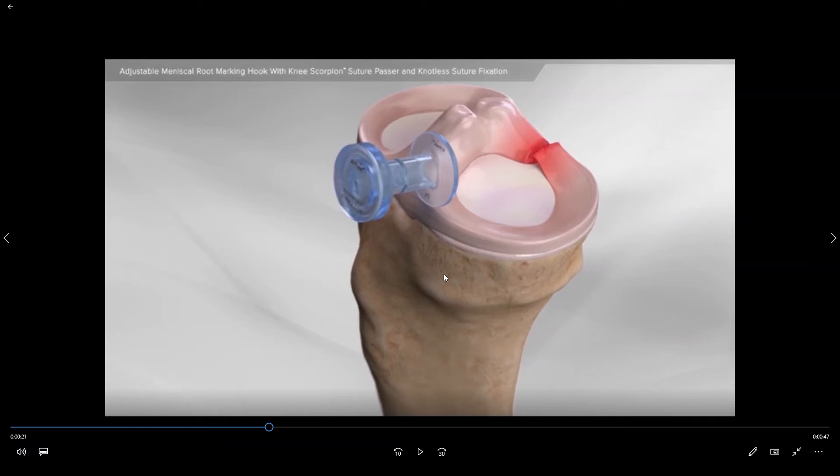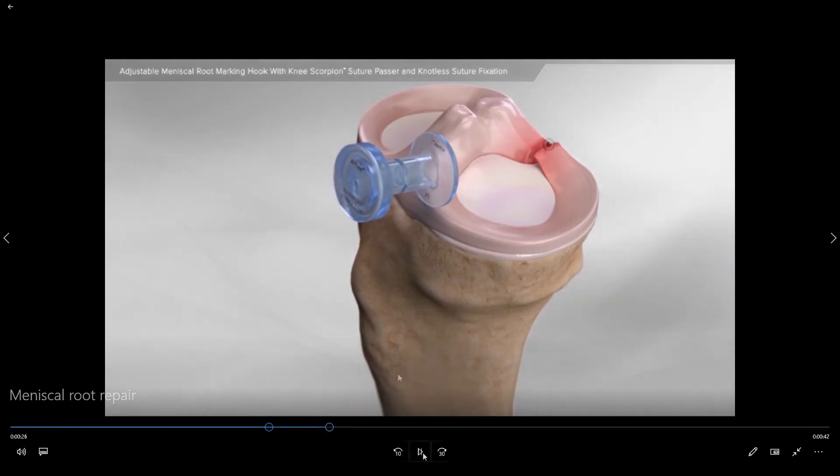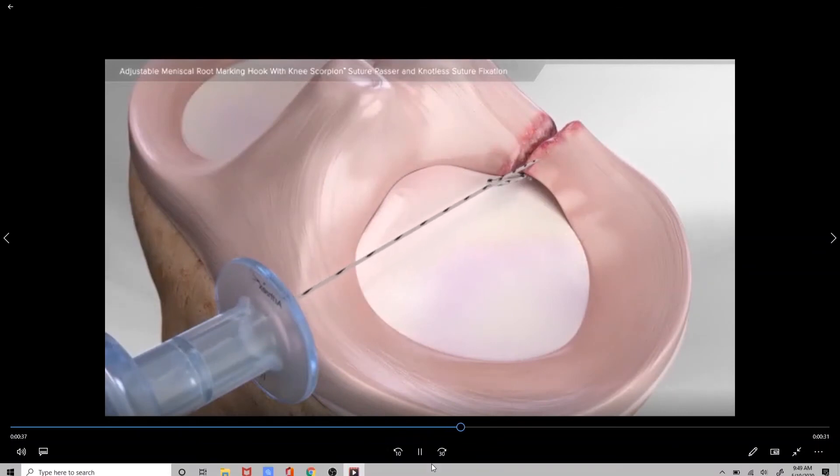In order to perform a meniscal root repair, we initially gain access to the joint through a small poke hole in the skin where a rubber cannula is inserted. As we look towards the back of the meniscus we can see this is where the meniscal root tear is, and so we want to reattach this torn piece of the meniscus back down to the floor.